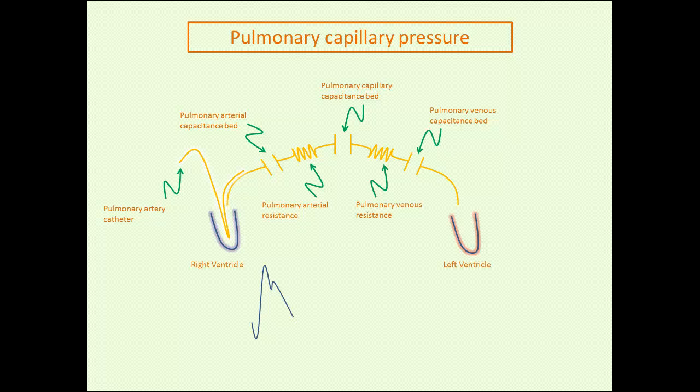And now what I want to illustrate for you is, imagine at the tip of your pulmonary artery catheter here, keep your eye right there, you're going to inflate your balloon, okay? So now you've instantaneously ceased blood flow across this circuit. And we're going to now follow that same packet of blood during a cessation of blood flow. So this is this packet of blood. You've inflated your balloon here, so this marks your balloon occlusion.